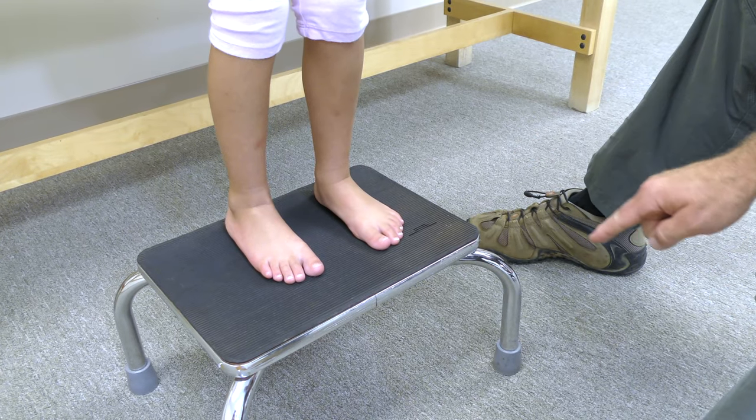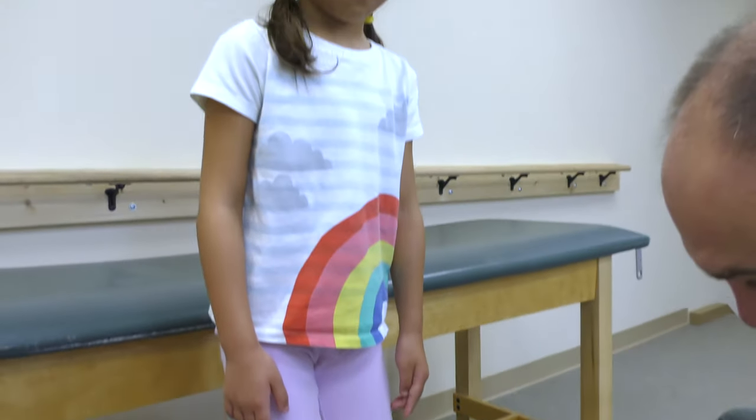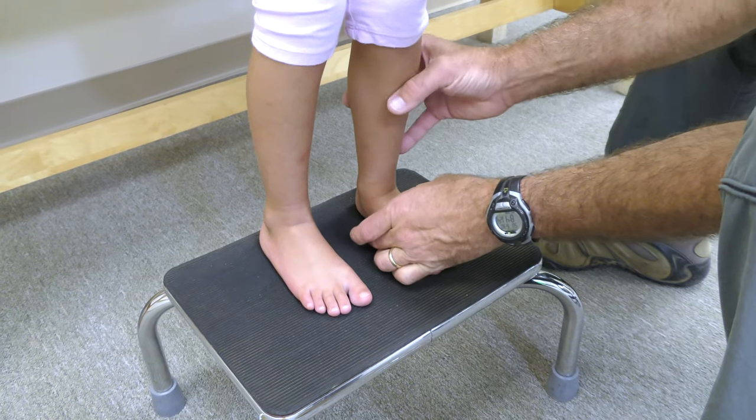Flat feet can easily be seen when a person is standing. Support to the arch not only gives proper alignment to the feet, but it may help with the alignment of the knees and hips as well.